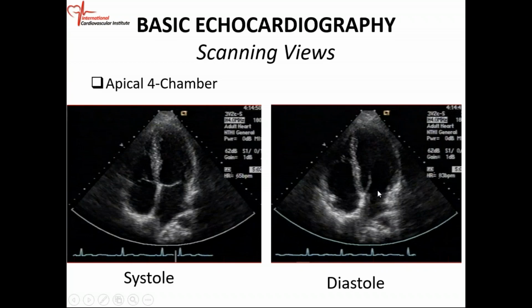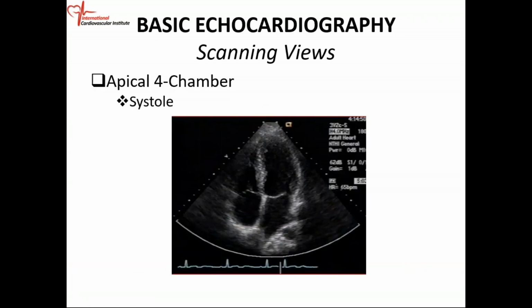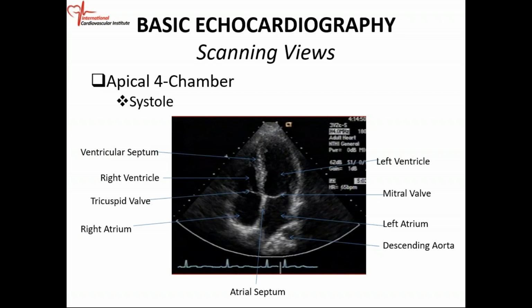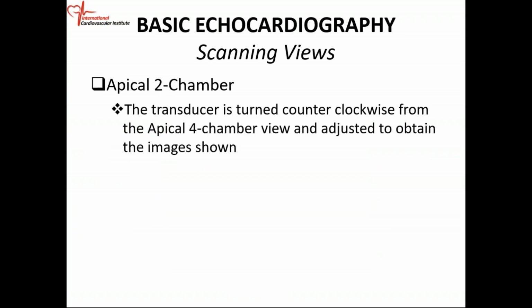In diastole, the mitral valve is open. In systole, the mitral valve is closed. Okay? LV cavity, mitral valve, left atrium, descending aorta, atrial septum, right atrium, tricuspid valve, right ventricle, septum. Okay?